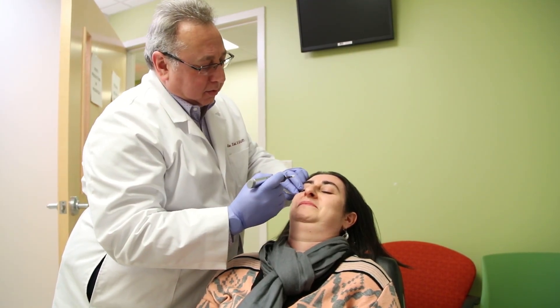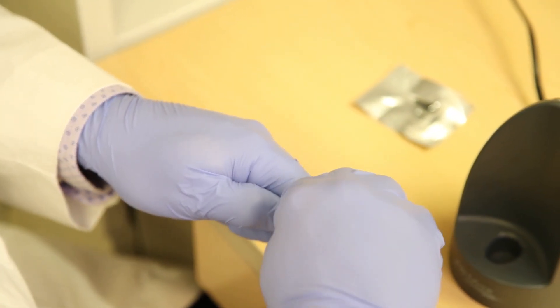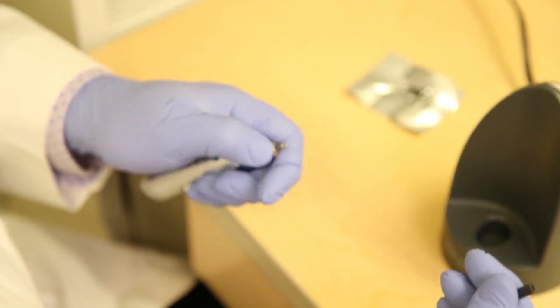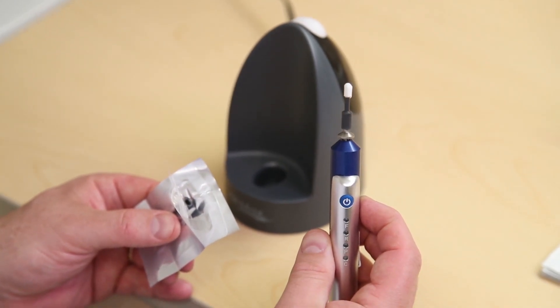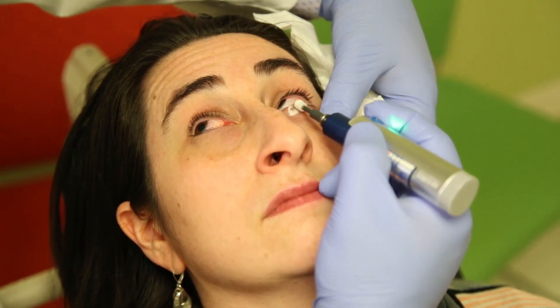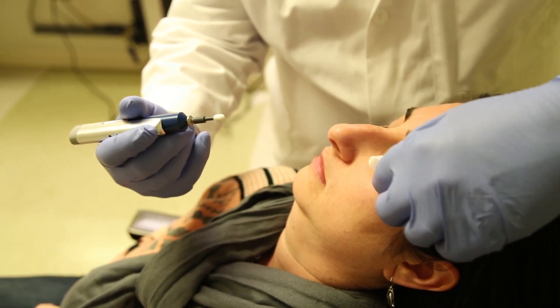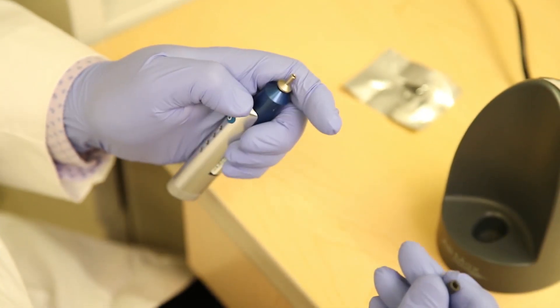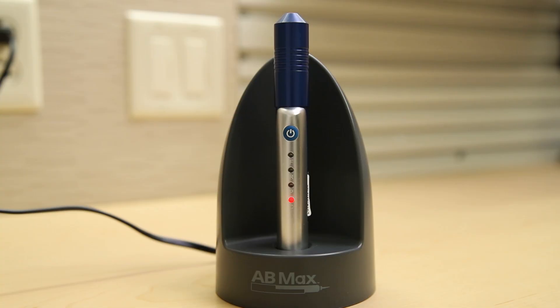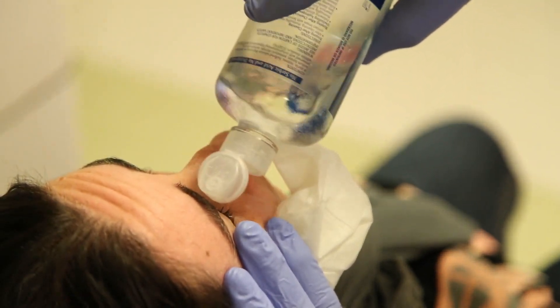After thoroughly cleaning the upper outer eyelid, press the power button to turn the unit off. Remove and discard the used tip and load a new, clean AB Max tip onto the handpiece. Soak the tip and repeat the procedure on the left eye. After all four outer eyelids have been treated, turn the unit off. Discard any used sponge tips and place the handpiece back into the charging station.